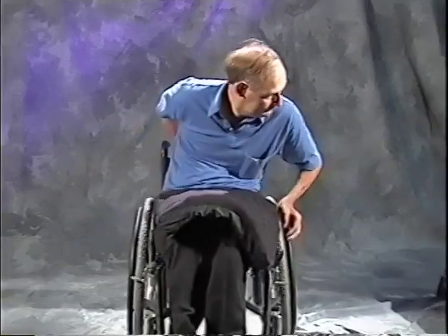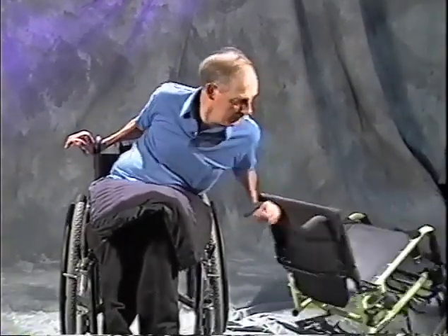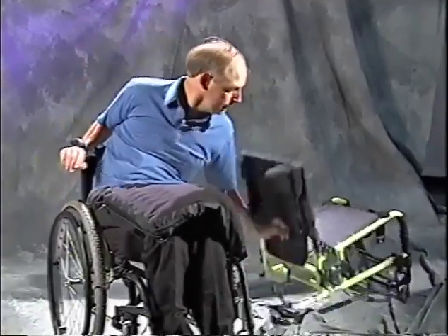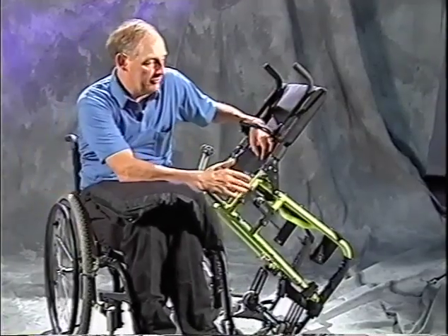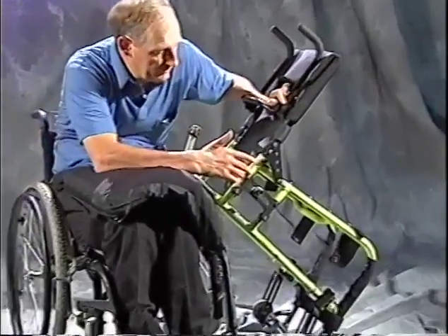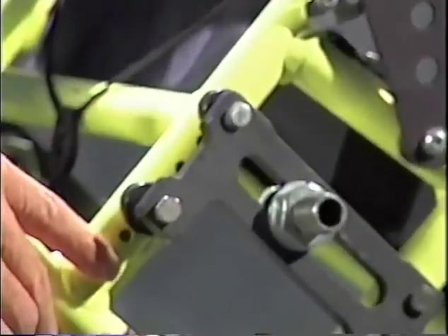Now you can raise and lower the axles of the chair, and why don't I just show you on this chair here. This plate, the axle plate on the chair, has basically 4 bolts on it, and there are holes underneath here.